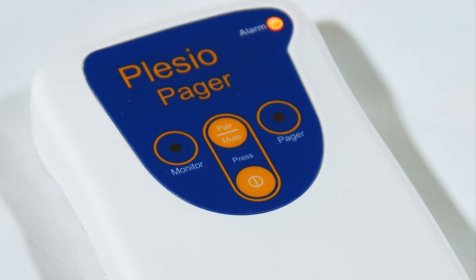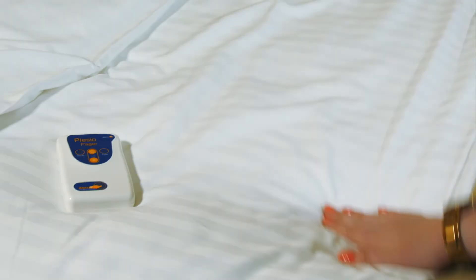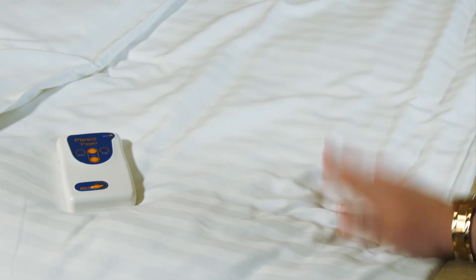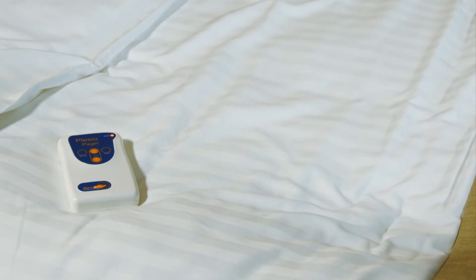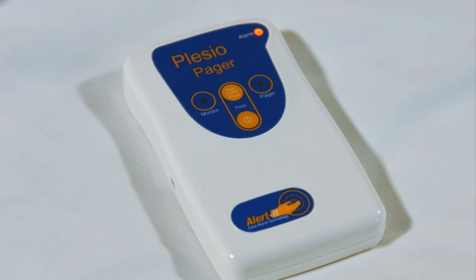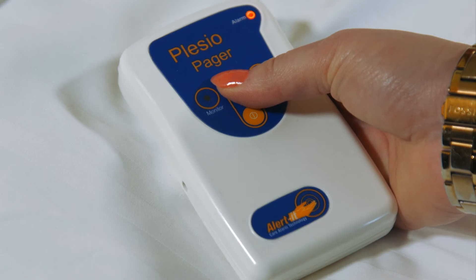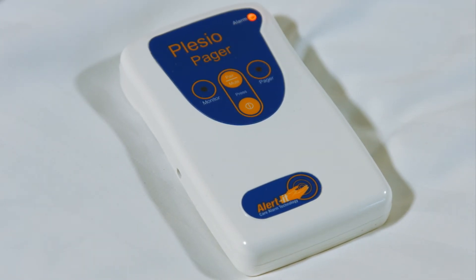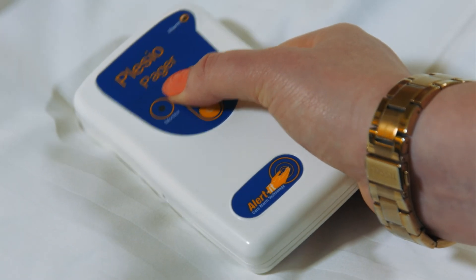You can now secure the Companion Mini in place using the provided cable ties or Velcro pads. The Companion Mini is programmed to detect movement for a period greater than 15 seconds. Upon detection, an alarm tone will sound and the Pager vibrates. You can temporarily mute the alarm and stop the Pager vibrating for a period of one minute by pressing the Pair Mute button. Once seizure activity ceases, press the button again to clear the alarm indication.